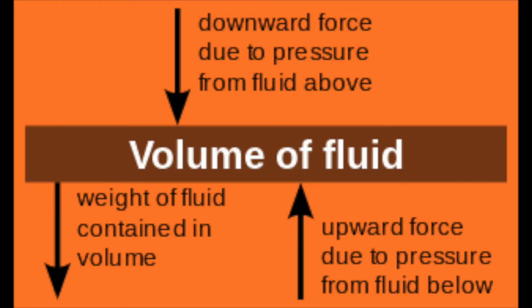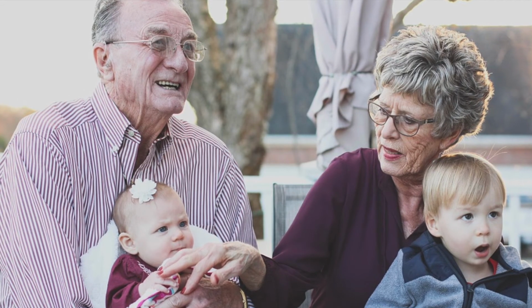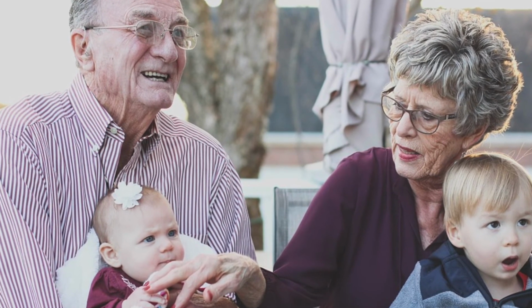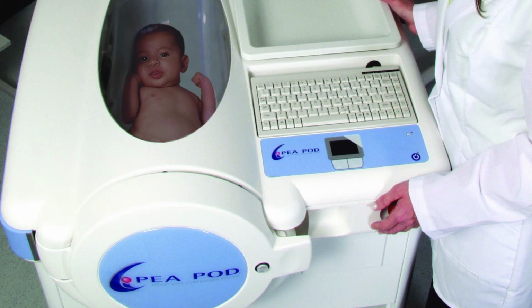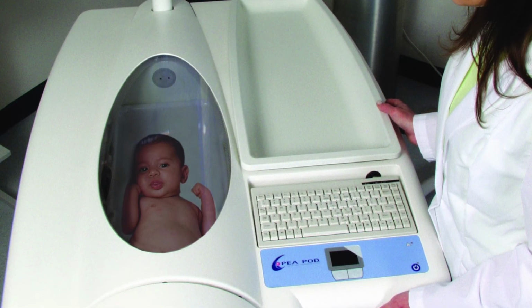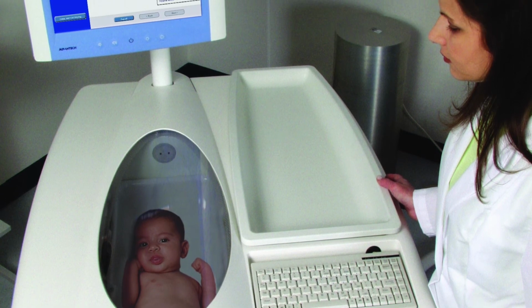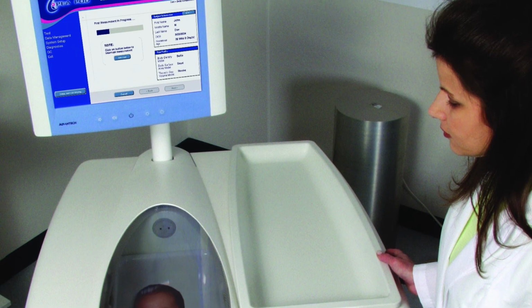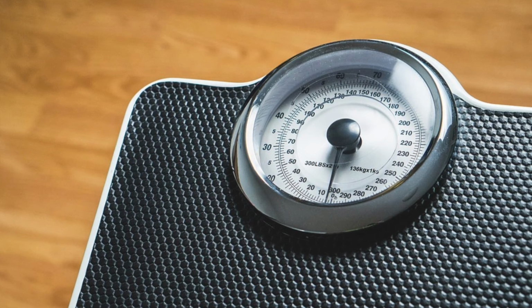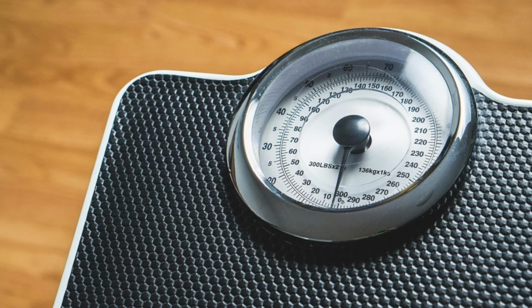Compared to the previous gold standard of hydrostatic weighing, ADP uses similar engineering principles but with air rather than water. This is advantageous as it prevents the patient from getting wet, making it more user-friendly for younger patients and the elderly. The BodPod has a seat insert for children between the ages of 2 and 6. However, different software and calibration standards are required. The data remains accurate for children as small as 12 kilograms. The normal calibration works for weights up to 250 kilograms.